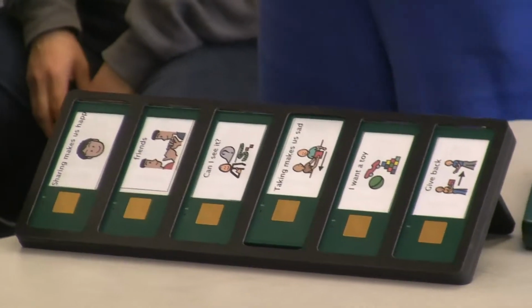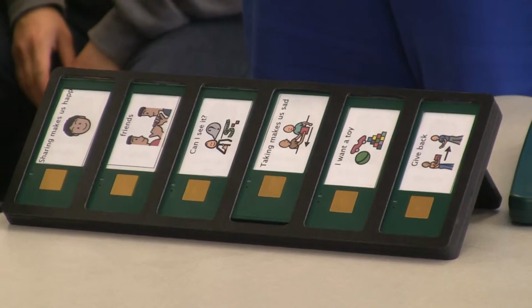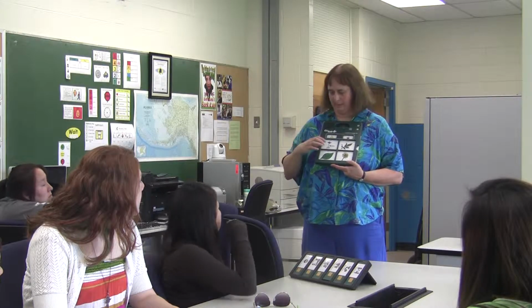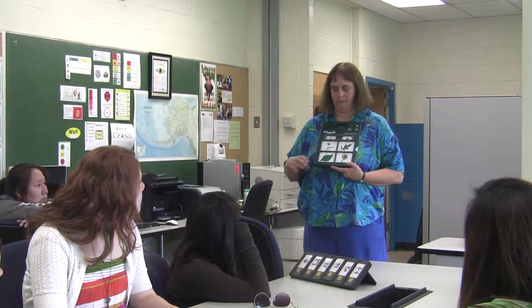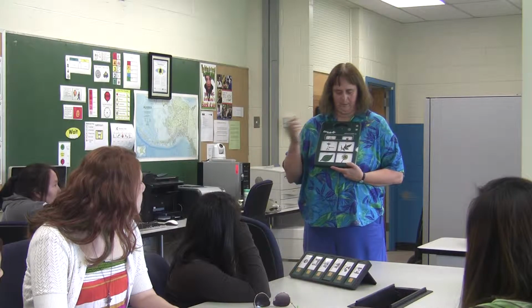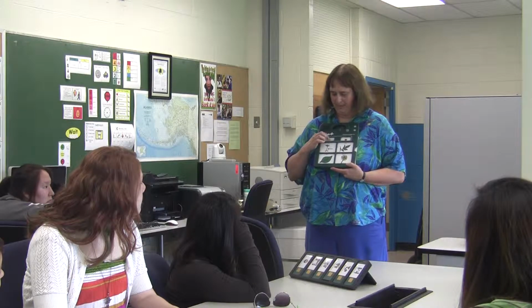The GoTalk 4s are for the student's voice, and so this might be for a science class and they're doing a test on the parts of a plant. And so when the teacher is pointing to a plant, they might say, well, what part is this? And the student would say, root, leaf, flower, oops, stem.